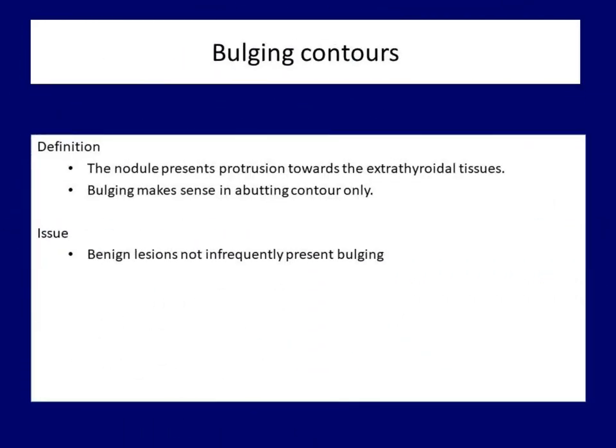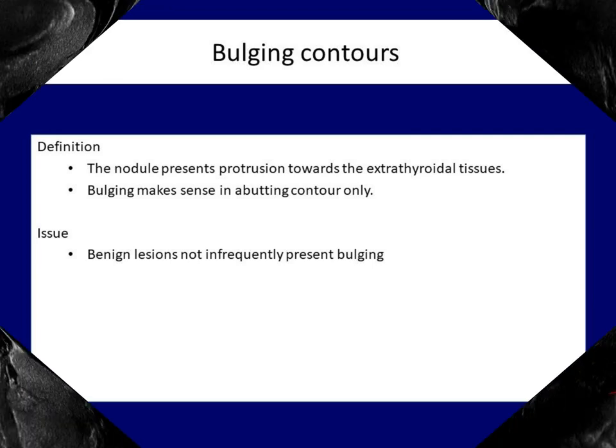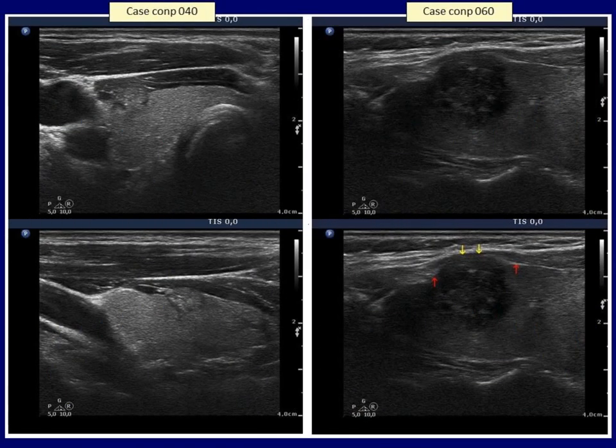Bulging is a special form of abutment. Bulging contour means that the nodule protrudes into anatomical structures outside the thyroid. Naturally, this is a more serious sign. However, even benign nodules might present bulging. We present here two examples — both papillary carcinomas presented bulging contours. The red arrows in the right case point to intact parts of the thyroid capsule, while yellow arrows indicate the most bulging part of the tumor.